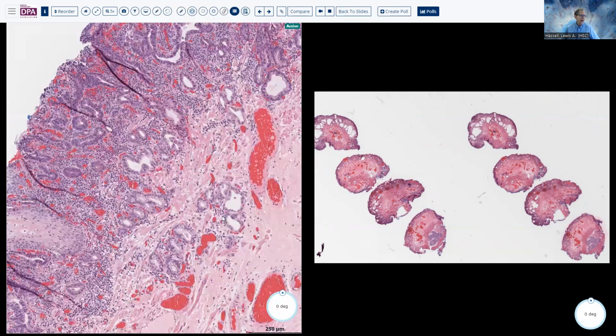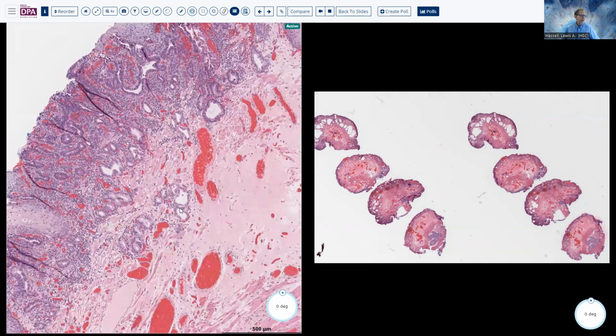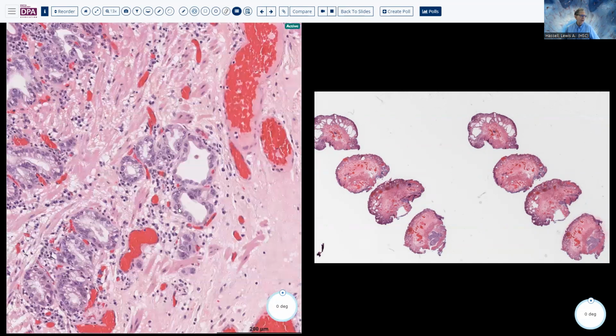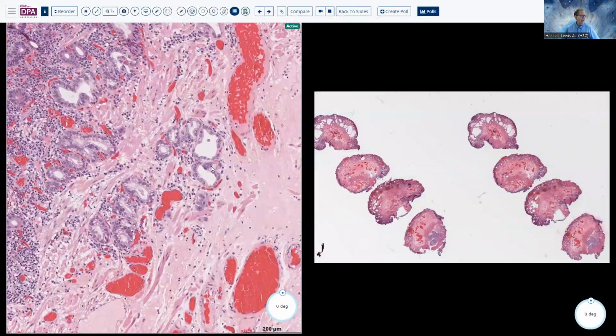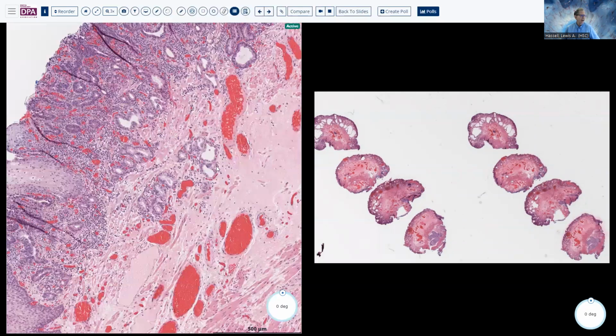And once you start to see that change, then there's another very subtle change that can creep in on you if you're not aware, and that's these small glands with seemingly shrunken cells. They don't look very worrisome from low magnification. They just look like dilated glands.